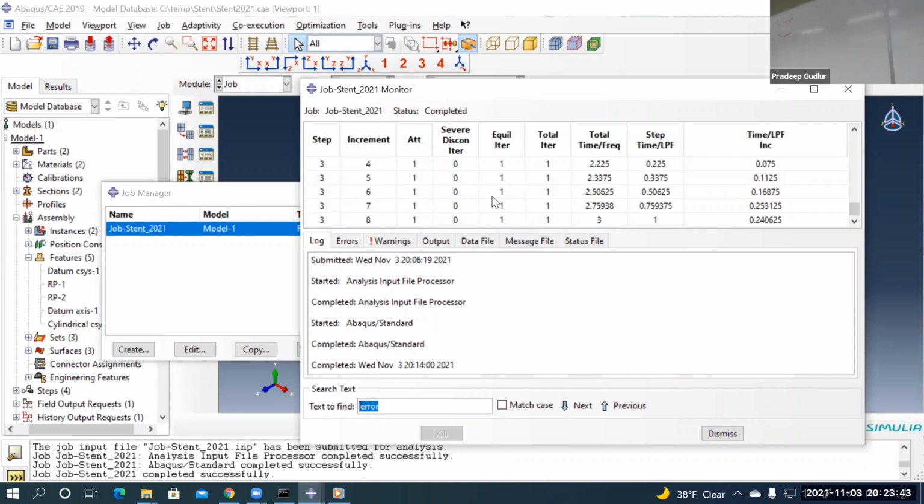Step 3, you're applying pressure. So there are some step definitions, with conditions. It's keeping on the step 2, created the extension. That's fine. So it's running, but you understood the problem. Right? Yeah.